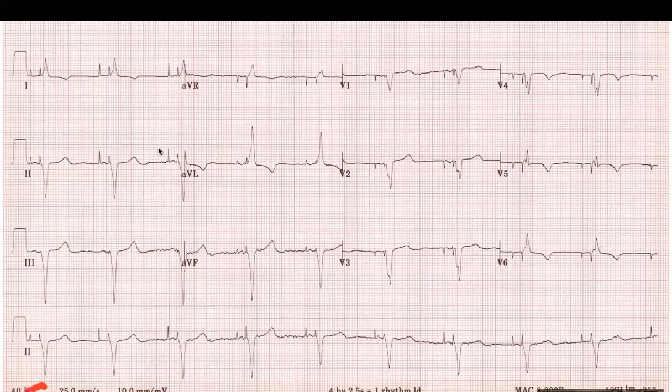There is an atrial pace and then there is capture. So for this beat, we're assessing the capture. So there is good capture. There is an atrial pace spike, and then capture. And if you go to the almost last one, there is a spike, but you don't see the P wave. So I think this might be loss of capture at the atrium. You could see the P wave very well in the previous complexes before. So the last one here, there is loss of atrial capture.